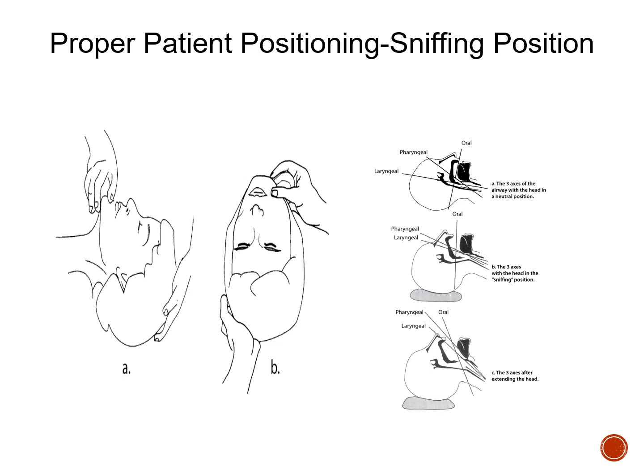But again, proper positioning, pulling the patient up, putting them in that sniffing position, unless it's contraindicated, can give the intubator a big advantage. I say that because that's really what it's about. I mentioned earlier tapering the cuff of the tube, kind of like an arrow rather than like a plunger. Positioning the patient, having one size smaller tube available, having a competent assistant there, or you being the competent assistant to somebody else, proper lighting. These are all things that can add up to a successful intubation versus one that's not or just takes much longer than it should.